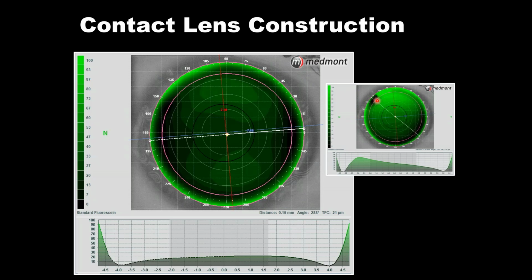Now, one of the considerations that you need to be aware of is the editing option can only be used with a single topography. It can't be used with the composite capture. So if you're dealing with a single topography that has error, edit that first before making your composite.